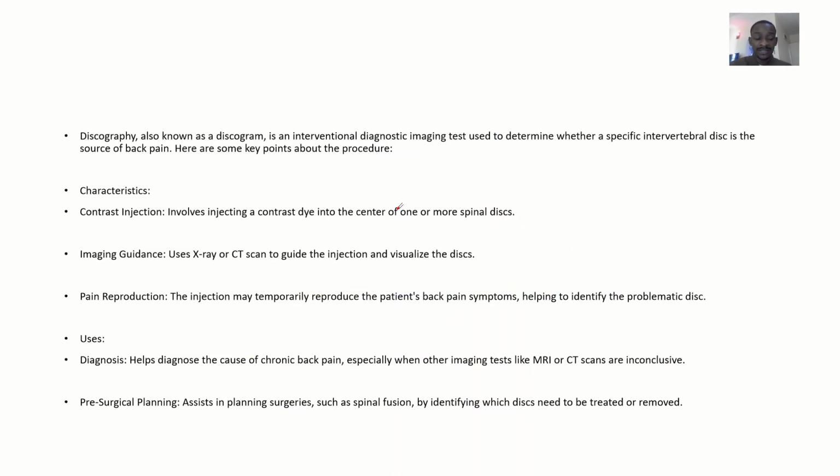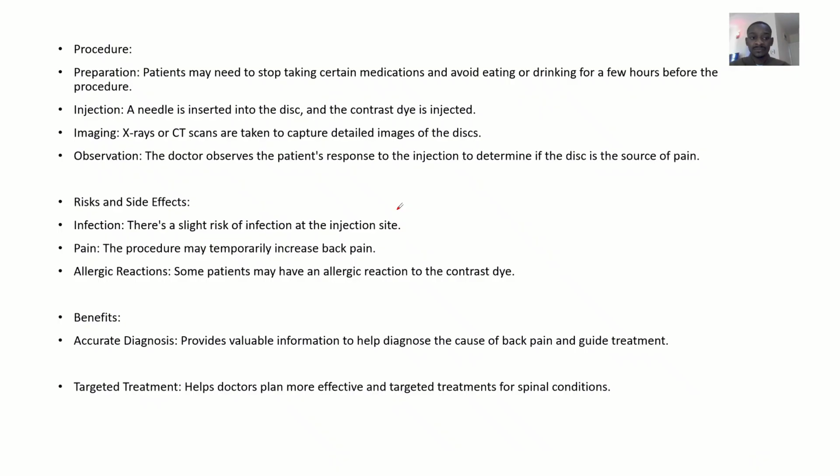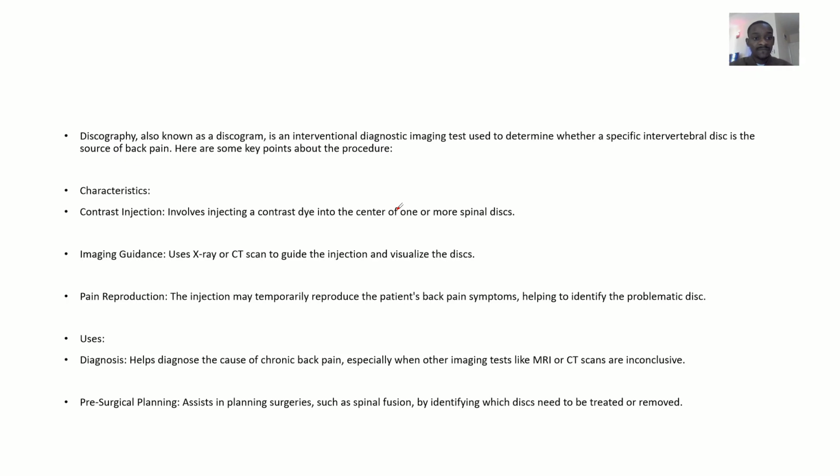We'll talk about the characteristics, the uses, the procedure, the risks and side effects of this type of imaging modality. Okay, so for this discography, we see that it is also known as a discogram. All right, so it's actually an interventional diagnostic imaging test. So interventional meaning it will help you to diagnose some certain spinal problems accurately.